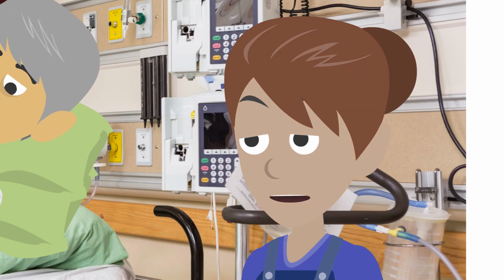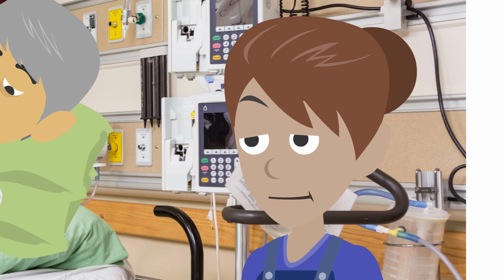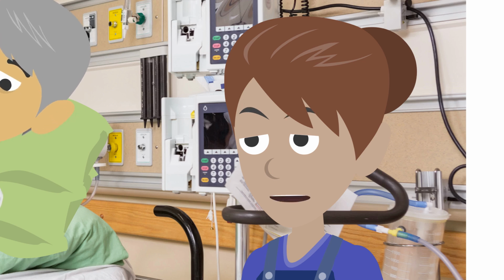Now the tube's in place, I'll put the used equipment, apron and gloves in the clinical waste bin, and then I'll sanitize my hands. After that, I'll make sure you are comfortable.